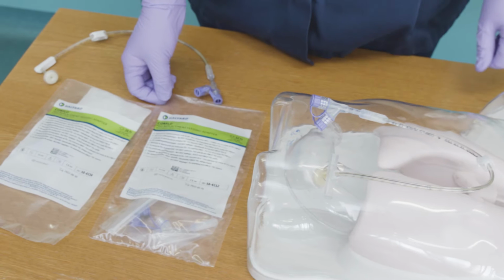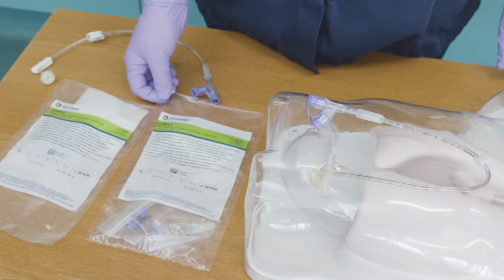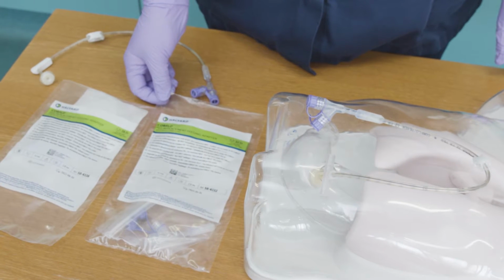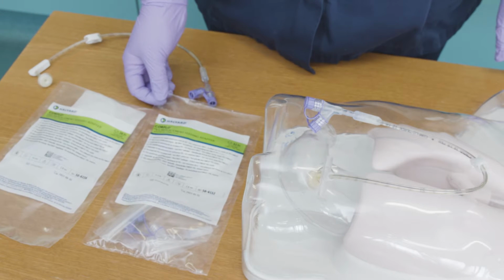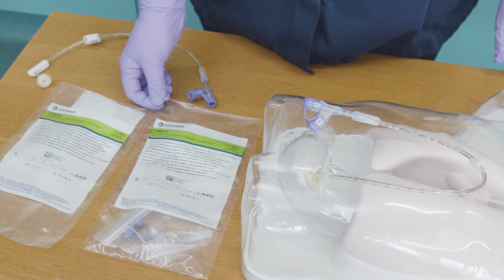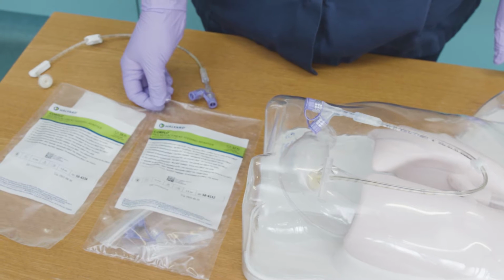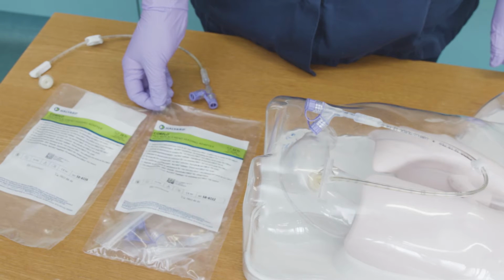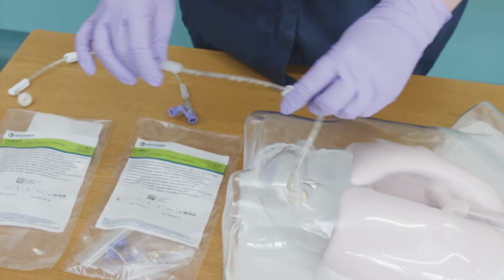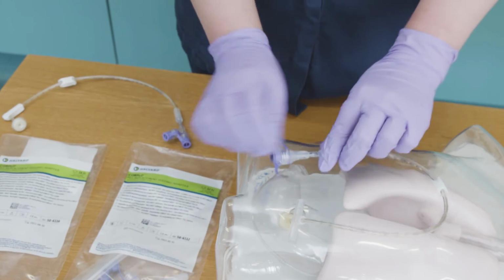Before replacing the Corflo wire adapter, wash your hands for 20 seconds. You should also wear gloves and apron if you're in a clinical setting. If you are changing the Corflo Y adapter for someone else, you will need to explain the procedure and gain consent from the patient or perform the procedure in the patient's best interests. Ensure the clamp on the Corflo PEG is closed and close the Y adapter caps.